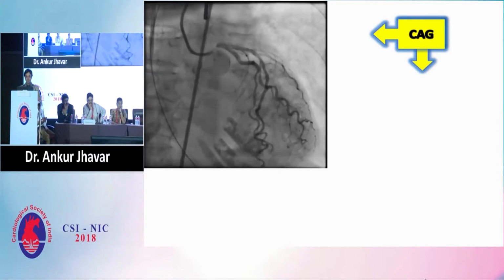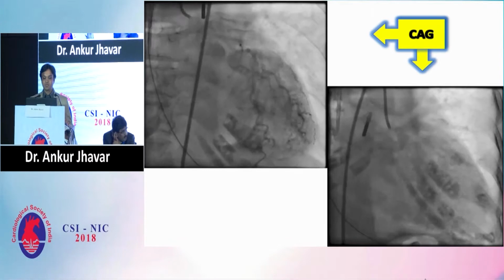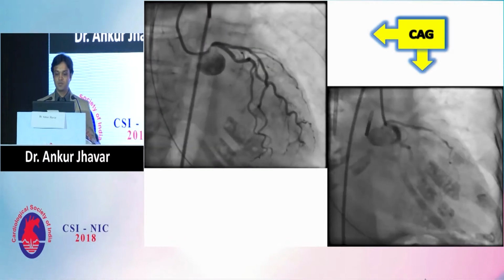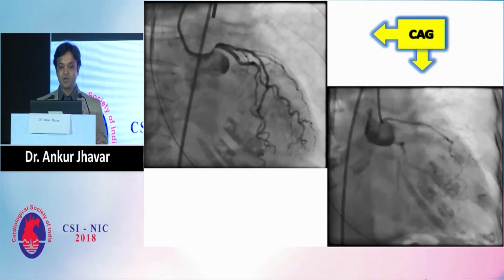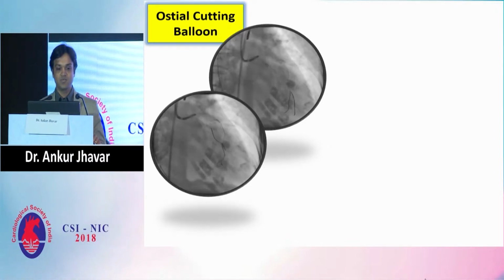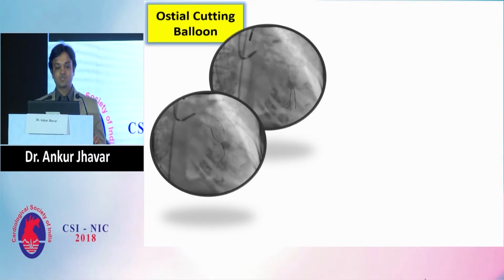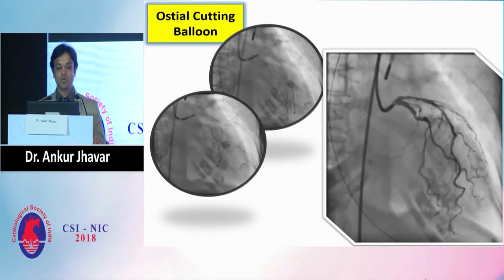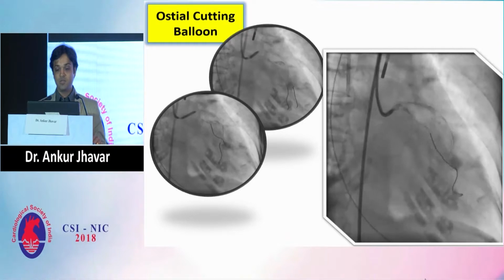This was her angiography. The angiogram revealed left main critical ostial stenosis and a non-dominant circumflex but a fairly big vessel, and a dominant right circulation. To start with the bifurcation, we initially wired both the arteries, the LAD and the circumflex, and we pre-dilated the ostial left main lesion with the NC balloon, followed by a cutting balloon. And this was the result after debulking the lesion.